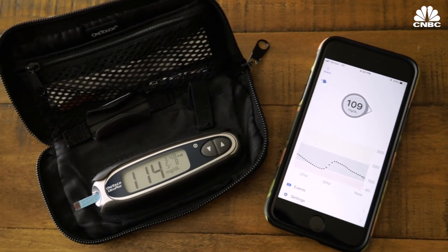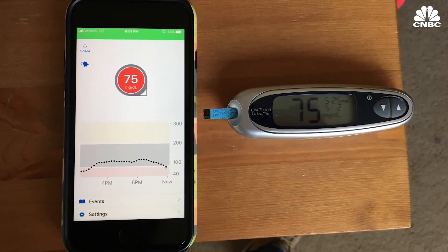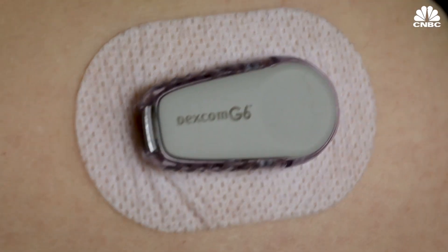After using the G6 for a couple of days, I'd say I'm pretty happy with it. It did take a little while to warm up, but after two or three days, it became so accurate that I found myself not actually double-checking the number in the middle of the day. You can wear this sensor for 10 days — previously, you could only wear it for seven.